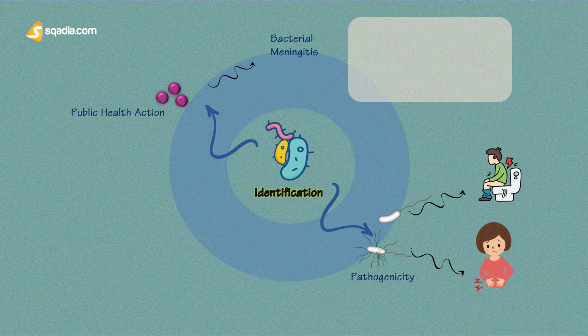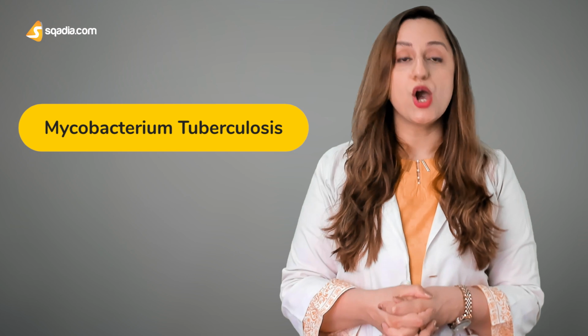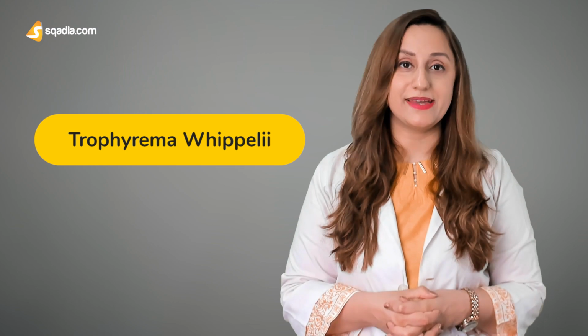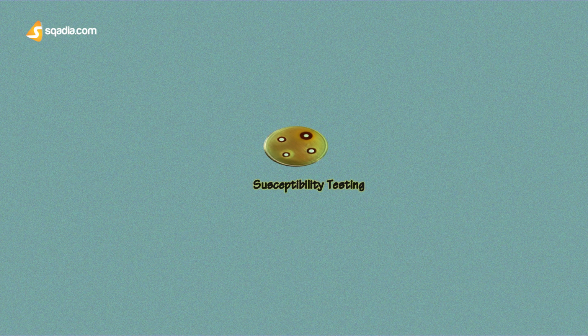Bacterial identification depends on colonial morphology on agar, microscopic morphology, biochemical tests, and increasingly nucleic acid amplification tests and gene sequencing. This is especially important for organisms that are slow growing, for example, Mycobacterium tuberculosis, or impossible to grow, for example, Tropheryma whipplei. Susceptibility testing aims to determine whether a treatment with a given antibiotic will be successful or not.